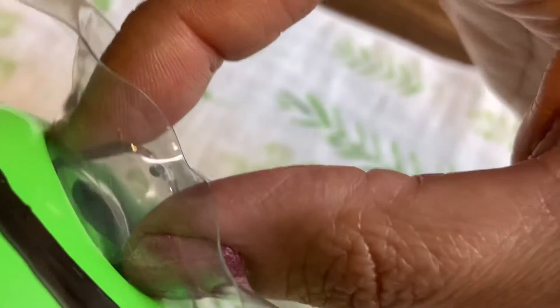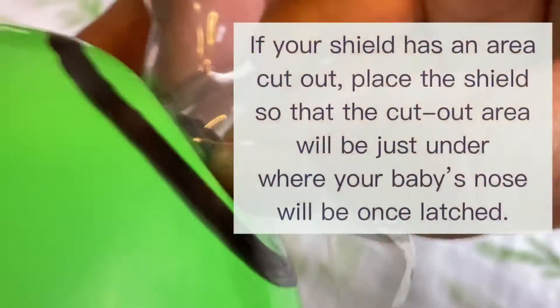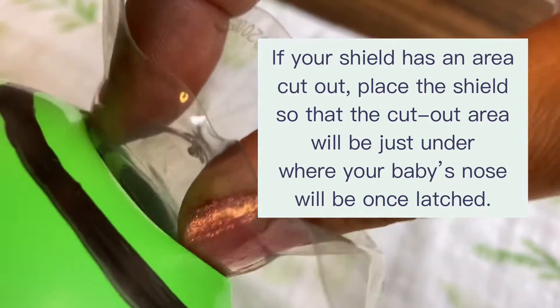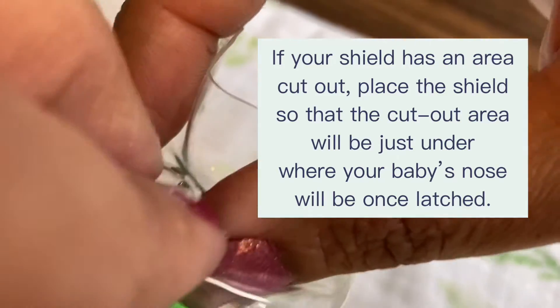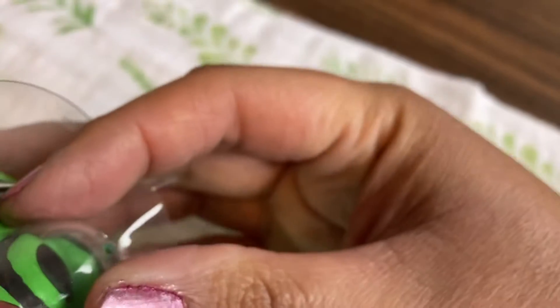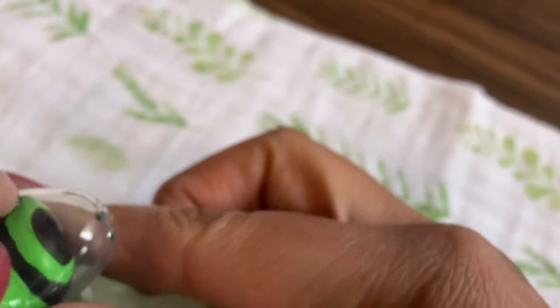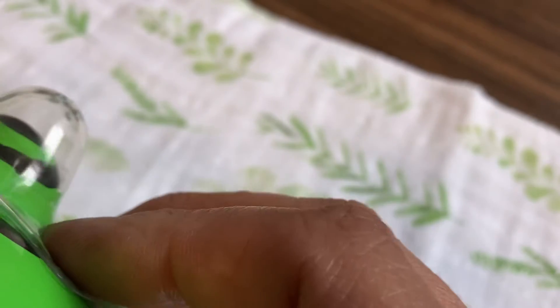Then you just place it right over the nipple tip and stretch it on nice and even. Some parents will use water on the wings of the nipple shield to help it seal better, but if you're not careful that can get very slippery.